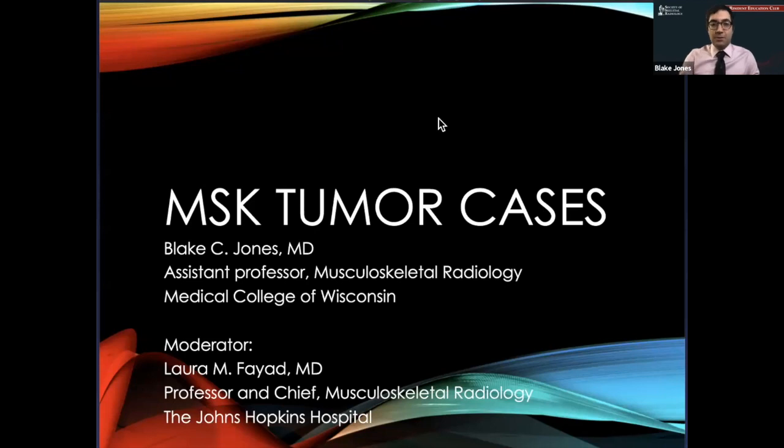So this evening, we're going to be talking about MSK tumor imaging, and I'm going to show you some cases that I hope will be educational, both from the standpoint of making the diagnosis, as well as using MRI to go through the thought process of an MSK radiologist looking at a tumor case.